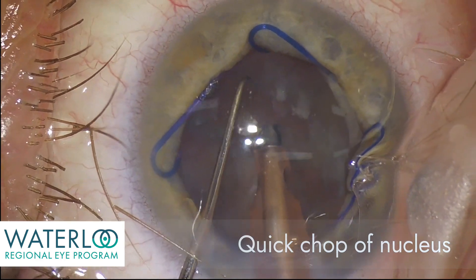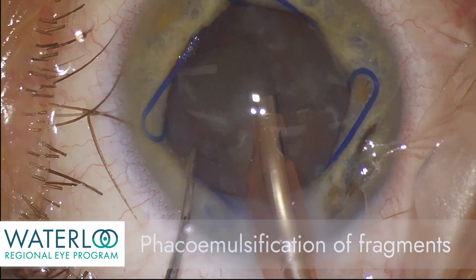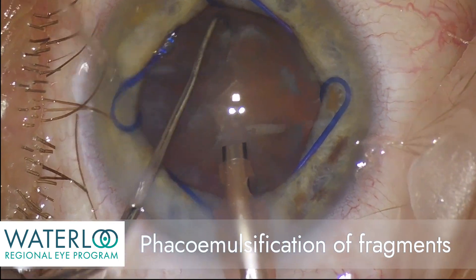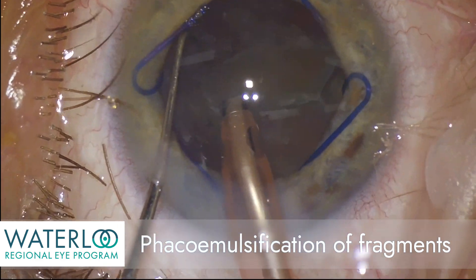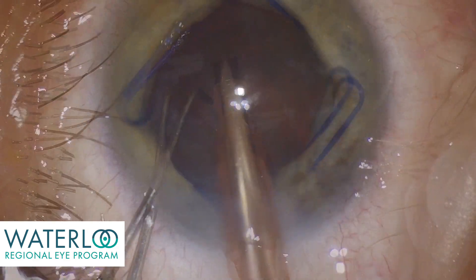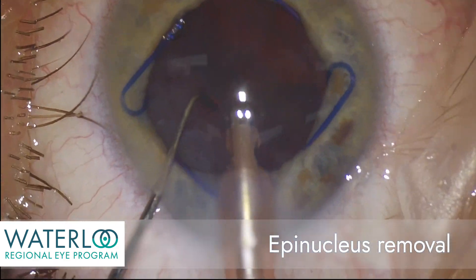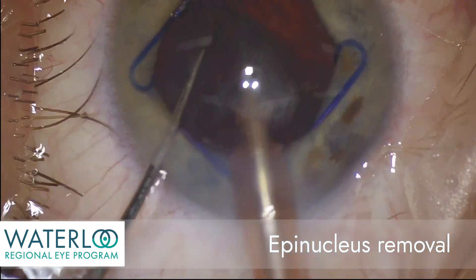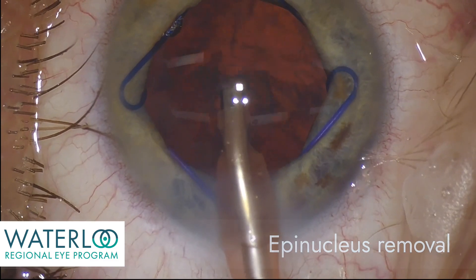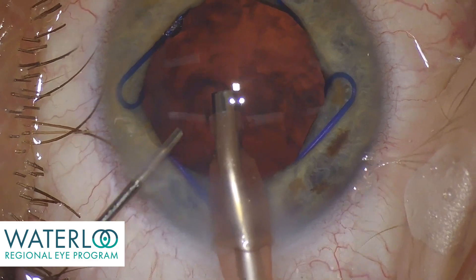These two fragments are now rotated and divided up into smaller segments, which are then removed from the eye as fragments using phacoemulsification. This is completed until all of the fragments are removed. The epinucleus is aspirated with the phacoemulsification handpiece and the handpiece is now removed from the eye.